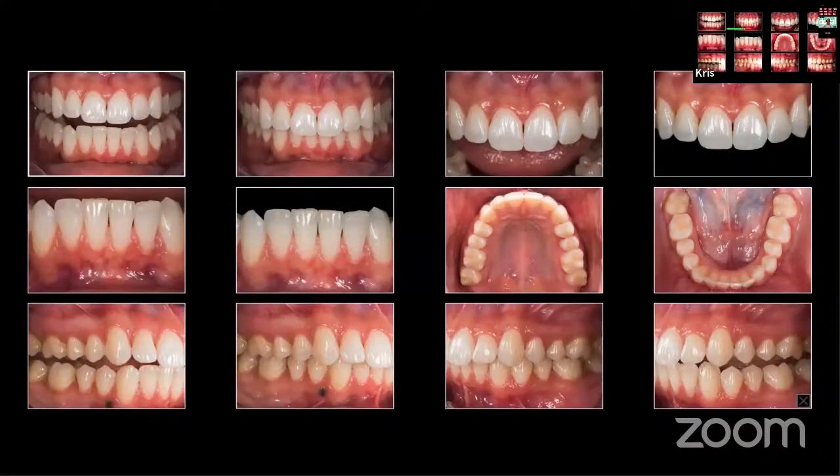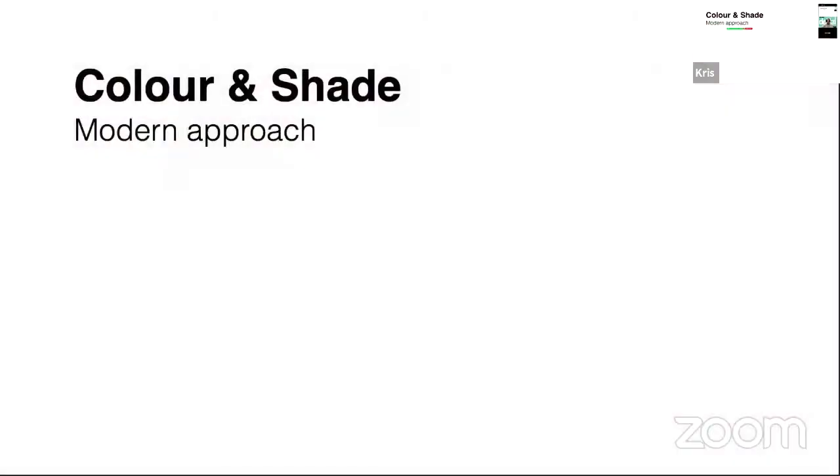Correct orientation means a protocol so that every case is done in the same way. It doesn't matter if it is just now, or in 5 years, or 10 years ago. The goal is that we have the same type of pictures which we can compare. Of course, besides this, you can take anything you want. But some basics, some foundations, should be done in a correct way.